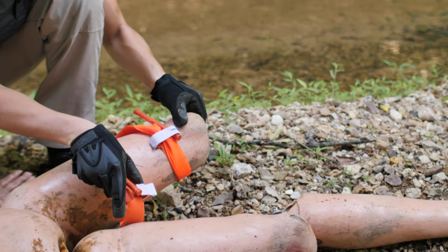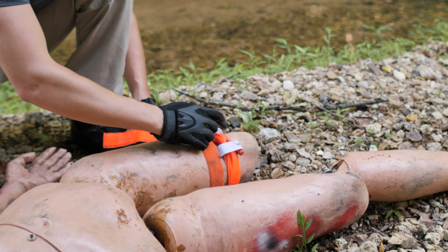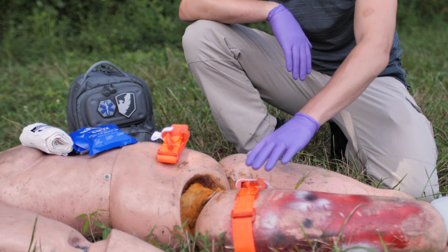So this is the perfect time to go back and make sure that that tourniquet is as tight as it needs to be. If you can't stop blood flow, now is a great time to go ahead and apply a second tourniquet right next to that first one. But this is the time where we reassess and make sure these tourniquets are working like we need them to. And we want to make sure that this is doing its job.